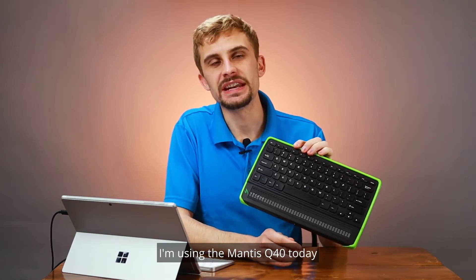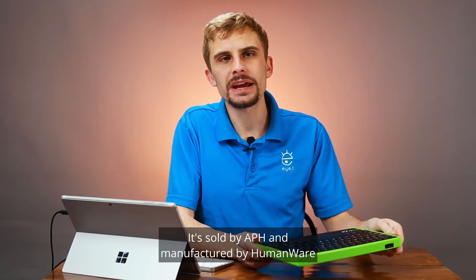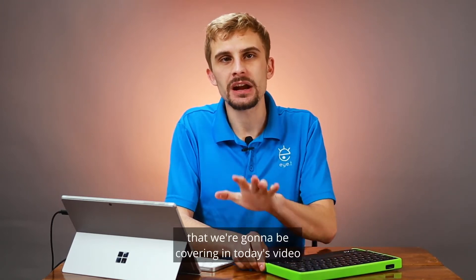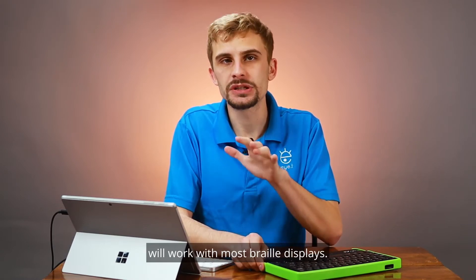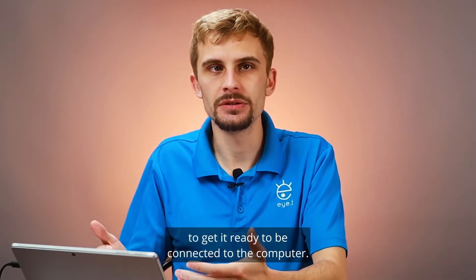I'm using the Mantis Q40 today because it's such an easy braille display to get started with. It's sold by APH and manufactured by HumanWare, but a lot of the steps we're going to be covering in today's video will work with most braille displays. First, let's set up our braille display to get it ready to be connected to the computer.